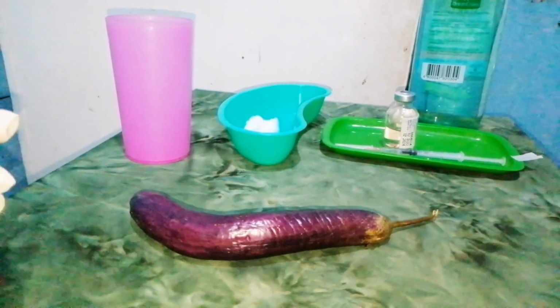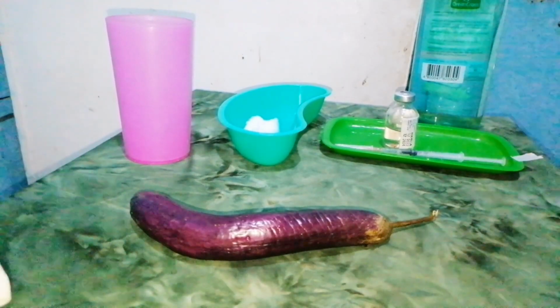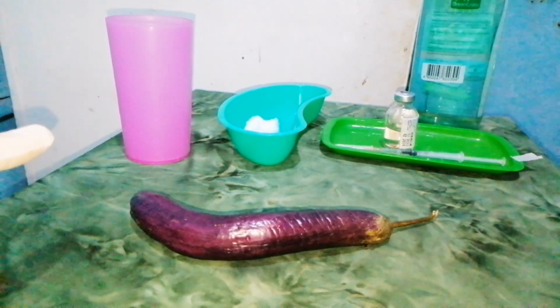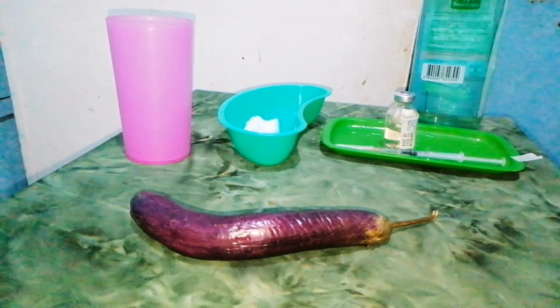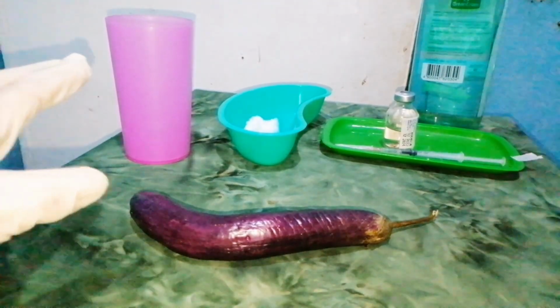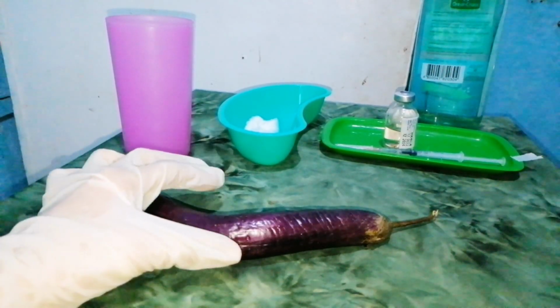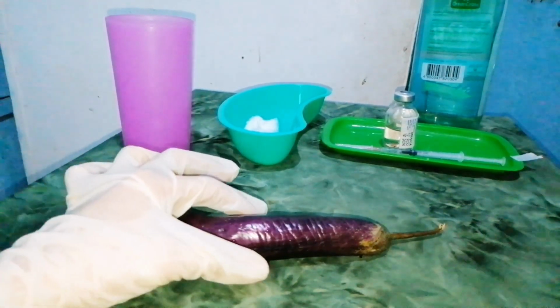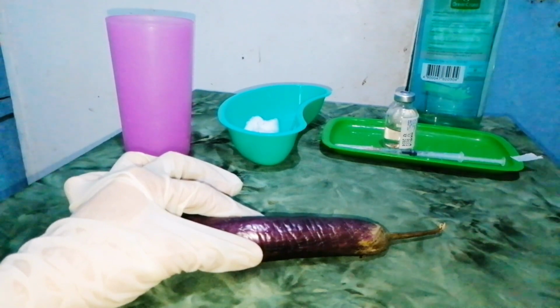Now, select and clean a site. Select a site free of tenderness, hardness, swelling, scarring, itching, burning, or localized inflammation. Select a site that has not been used frequently. Then apply clean gloves. As agency protocol indicates, clean the site with an antiseptic swab, starting at the center of the site and cleaning in a widening circle about 5 centimeters or 2 inches, and allow the area to dry thoroughly.